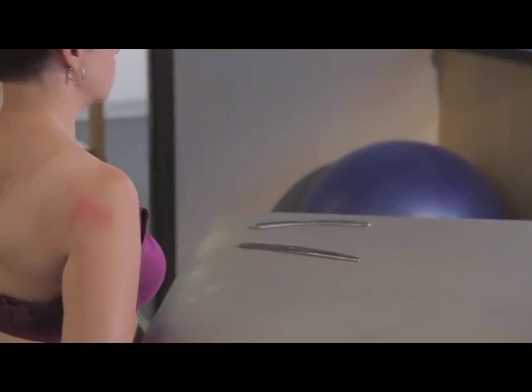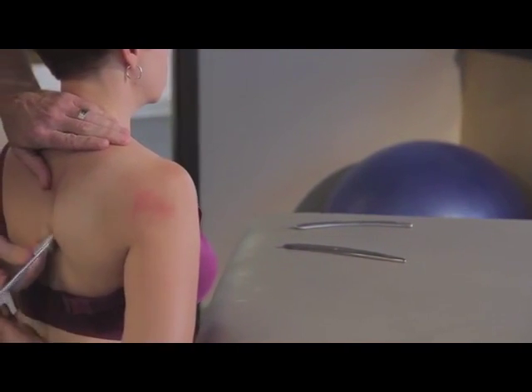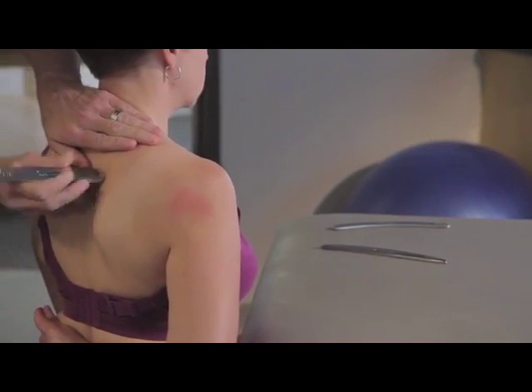So we use the instruments diagnostically to identify areas of restriction or fibrosis or dysfunctional soft tissue. Once we identify those lesions, we can very specifically manipulate that soft tissue with the instruments.